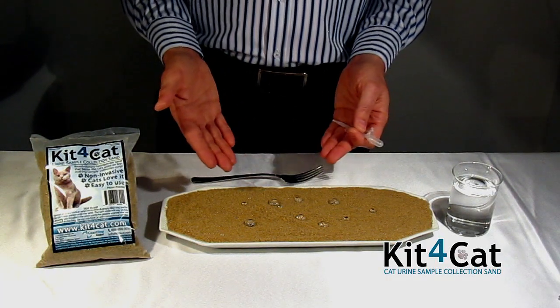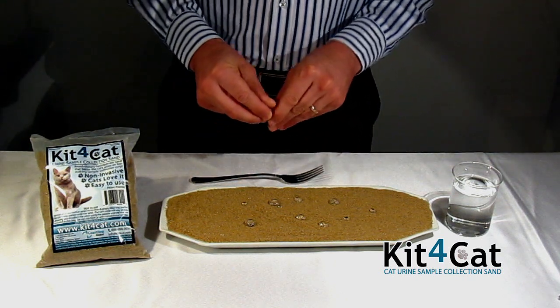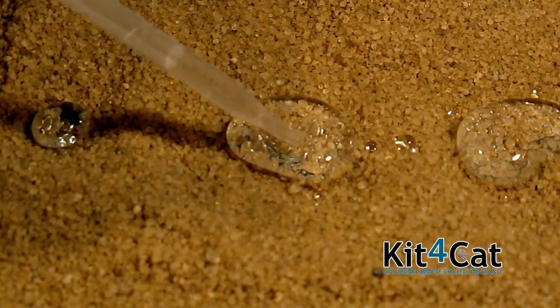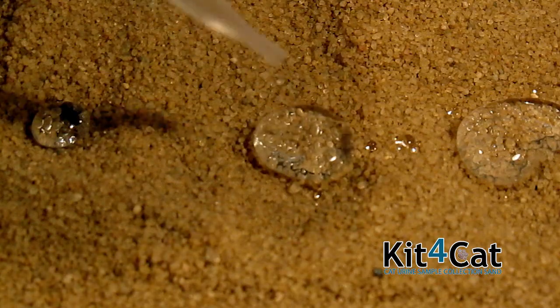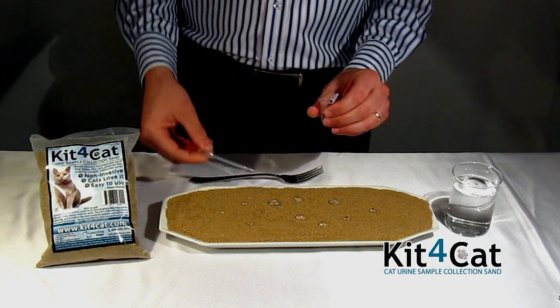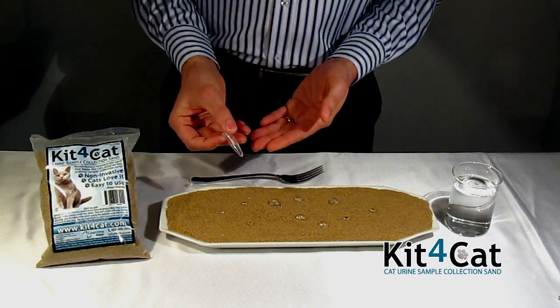Once the cat has urinated on the sand and has moved away, you can quite easily collect the urine sample in the included pipette and vial. As you can see here, the urine is being extracted from the sand completely cleanly without any residue from the sand whatsoever. Once the vial is closed, it can be transferred to the laboratory for further analysis.